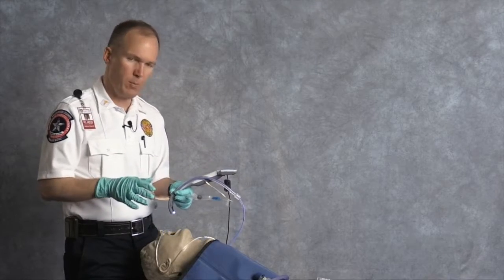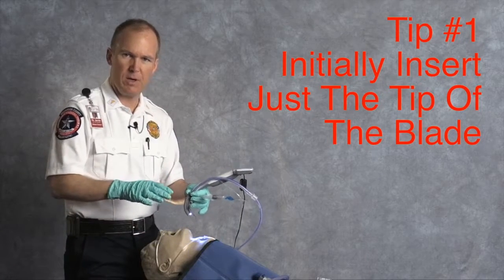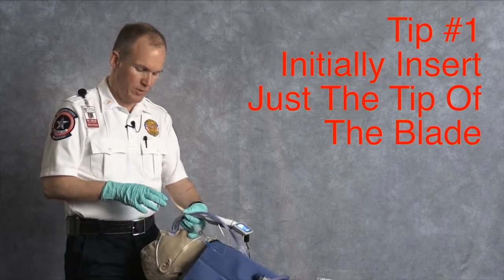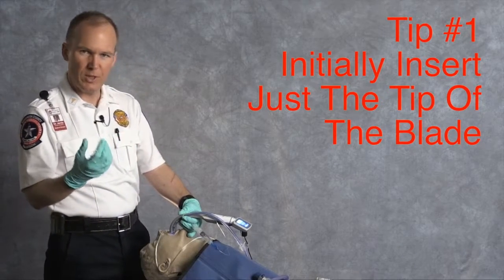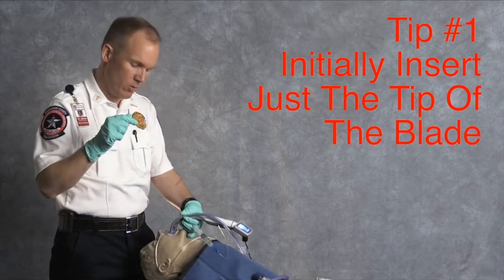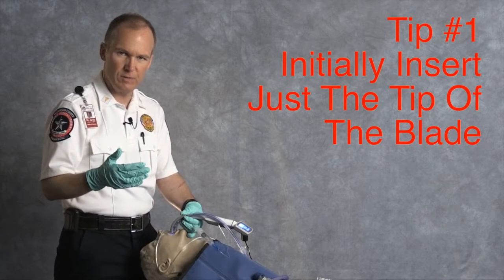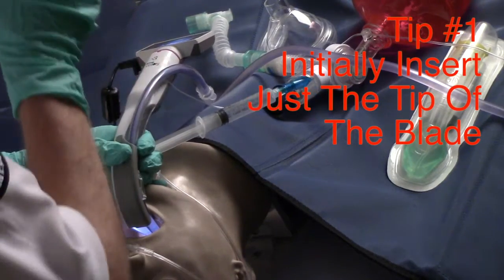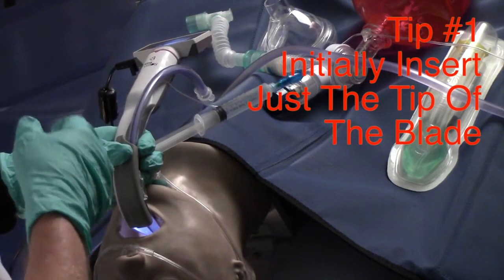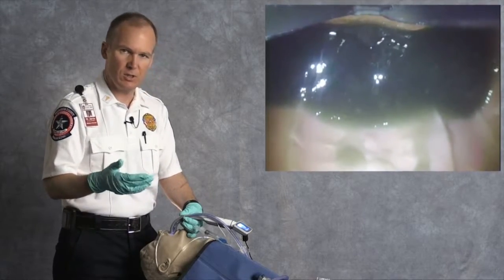The first tip we're going to go through is don't automatically put the blade as far into the mouth as you can. Go with just the tip of the blade. The reason we're trying to do this is if you put the blade into the muck, you've already lost. You've lost your view. You want to put the tip of the blade just into the mouth so that you can now see the muck there. So we see an awful lot of muck. So what we probably ought to do here is start suctioning.